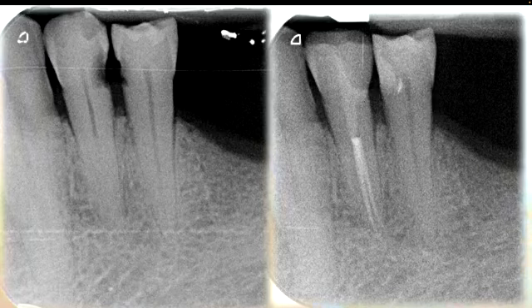As you can see, I tried to be as conservative as possible in the management of this kind of tooth because the patient is not young, he has some problems because there are some molars missing, so I want those premolars to resist as much as possible to the occlusal loads.